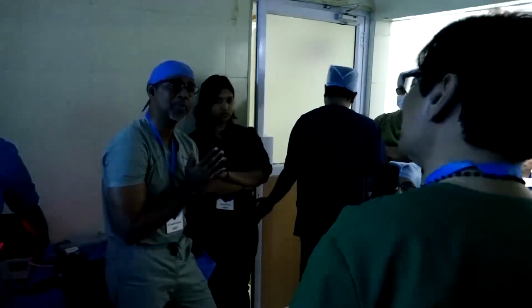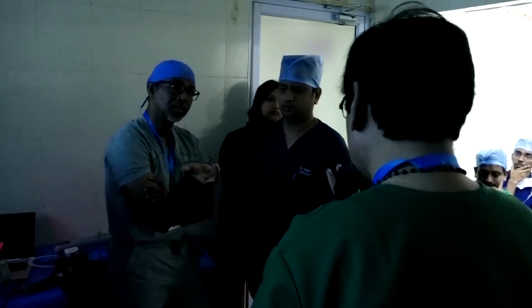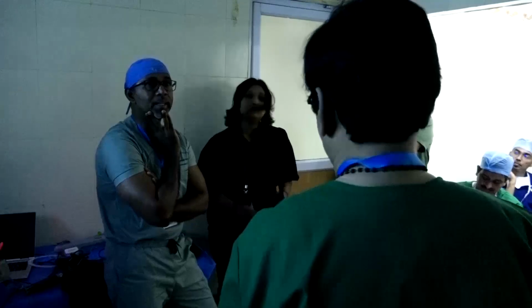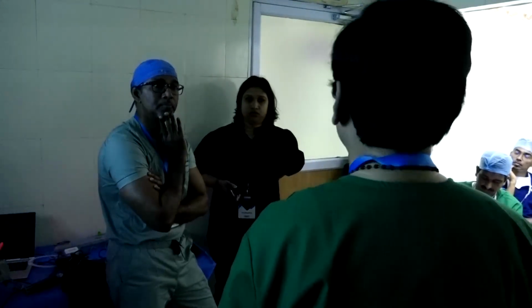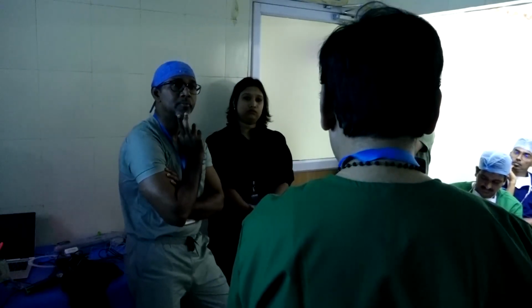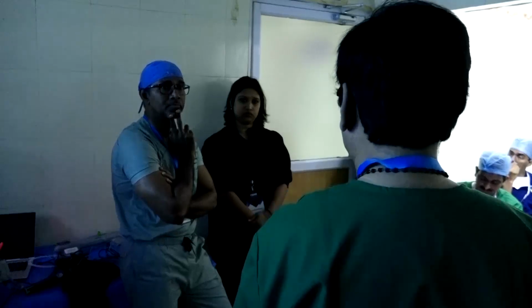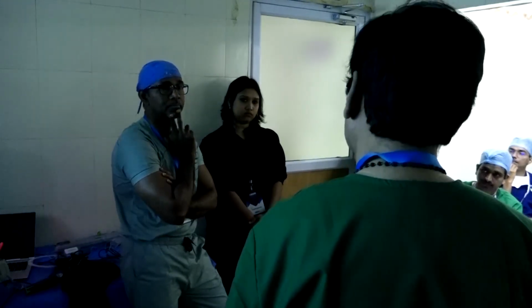Yes, it came back. That's why I'm telling. Only with both combined did it not come back. Once you reduce the volume, that's all. Without reduction of the volume for the nodule, there is a high rate of recurrence. Just modifying the plaque and compressing it, it will come back like a ball. Reduce the volume, then do the rest, then it is safe, with no recurrences.